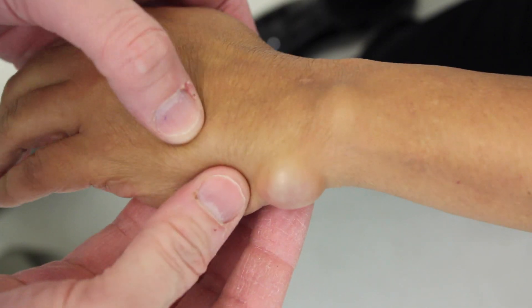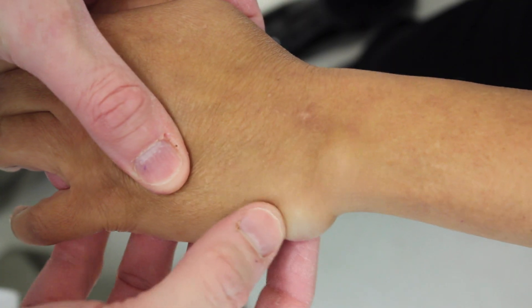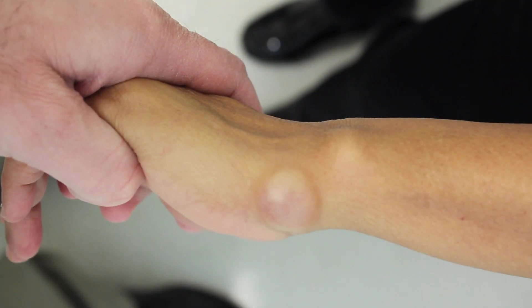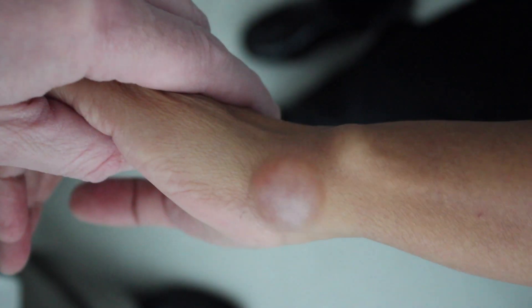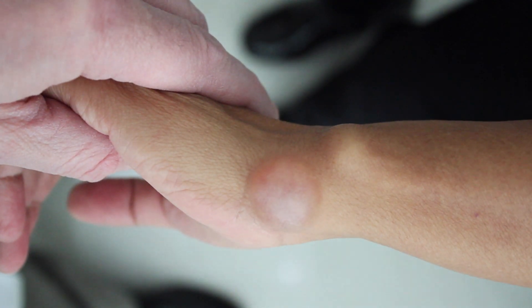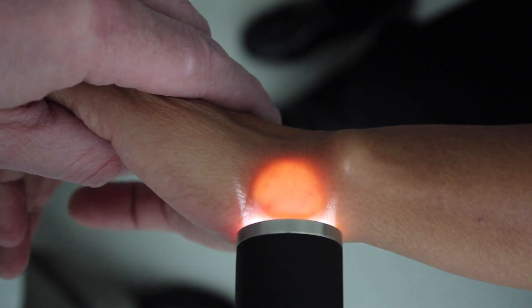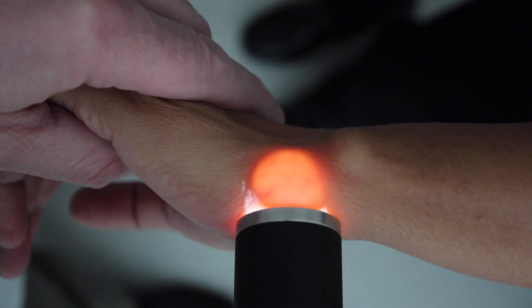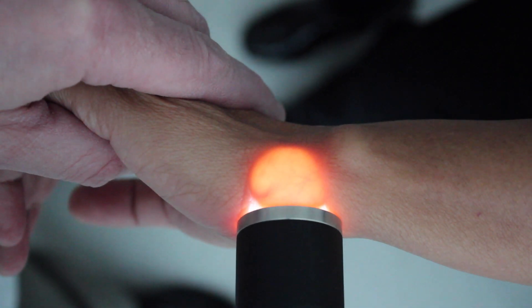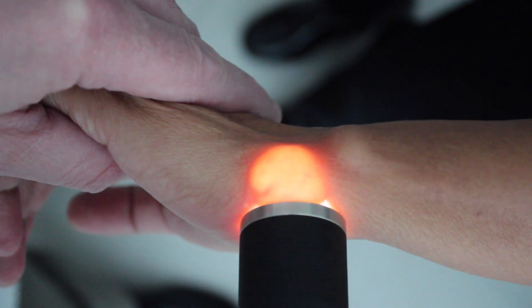This is where transillumination will really help to determine the pathology. The lights are turned down, and using a flashlight, I bring it up to the mass. As you can see, it's very clear and bright all the way across, indicating that this is fluid-filled and not solid.